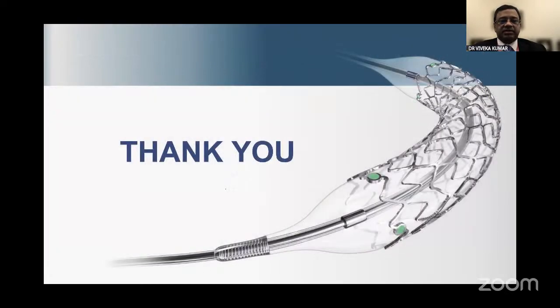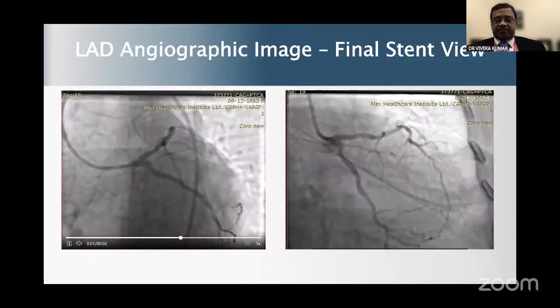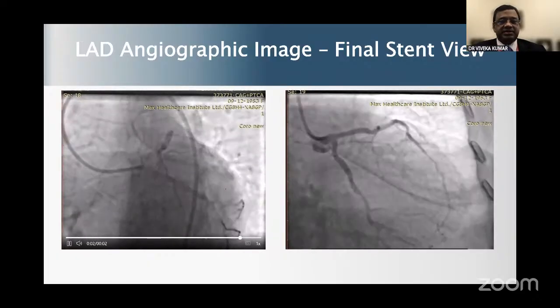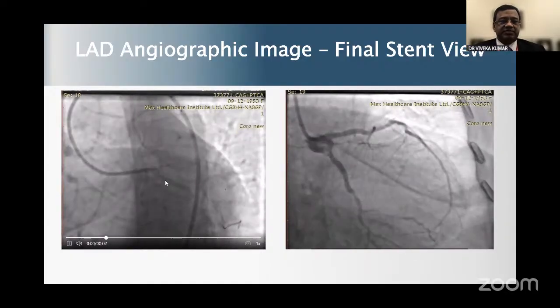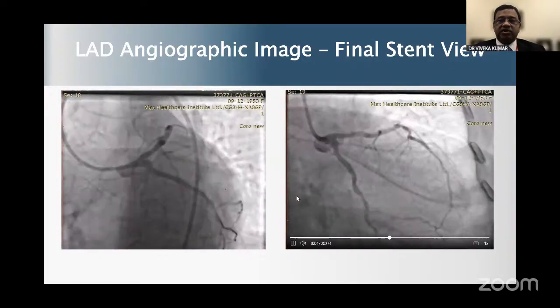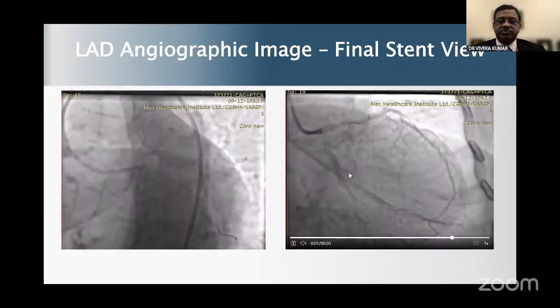As far as the characteristics of this stent are concerned, the good things about this stent, which we had already shared, are the trackability in this tortuous segment, and if there is a calcific spur, it will go quite easily. The second thing is that its long-term outcome will also be good, as the registry has shown that the 2 years data is good.